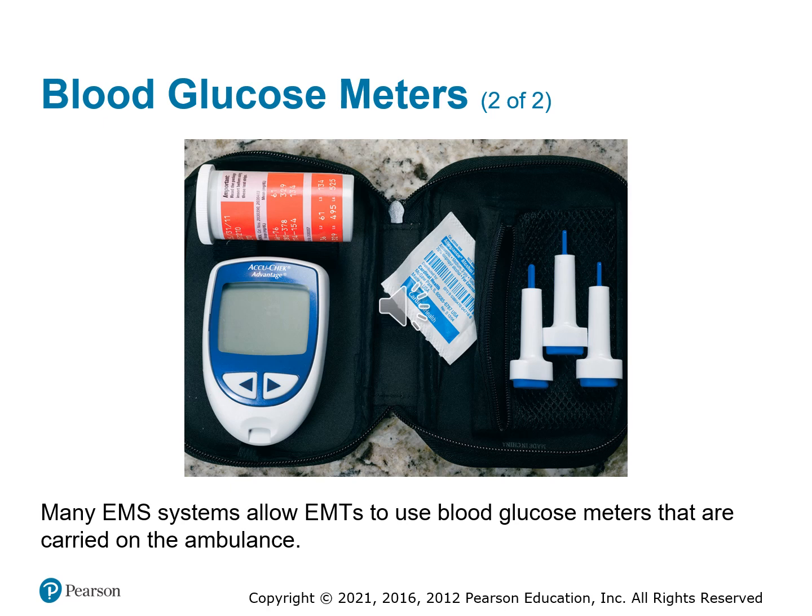On the far right side are what are called lancets. You're going to pop that blue tab out of the end of the white, and then when you depress the blue on the other end, it'll rapid fire a small needle. You can do this really any place that you can draw blood out of the body. Commonly it's on the fingertips or on the palm of the hand.